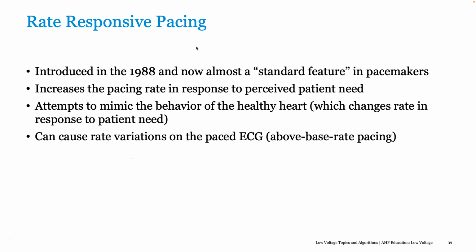Okay. So regarding intermittent AV block, would you think shortening the AV interval would help it? Or would we want to just see how much intrinsic activity would go in and then just back up the pulses?